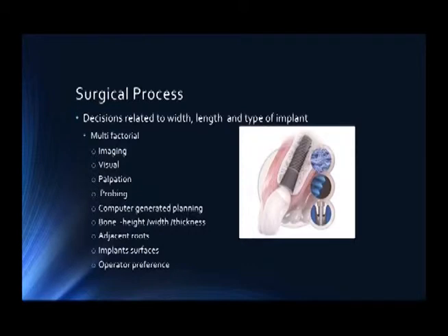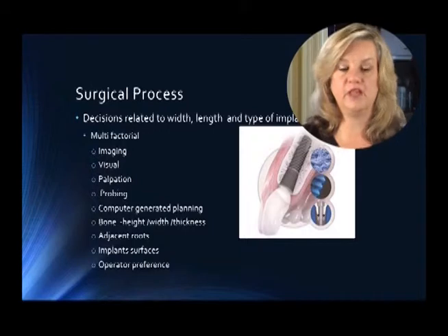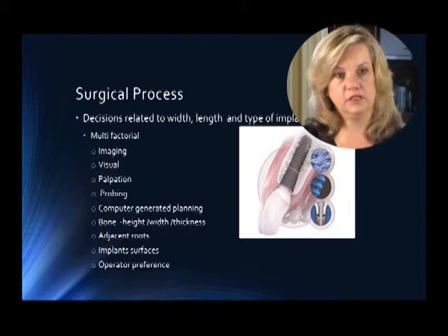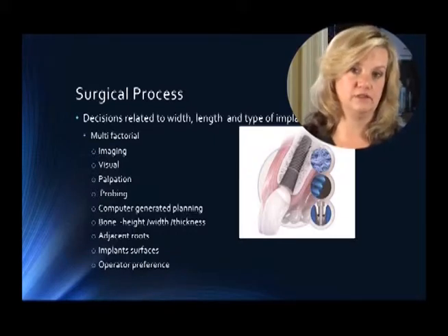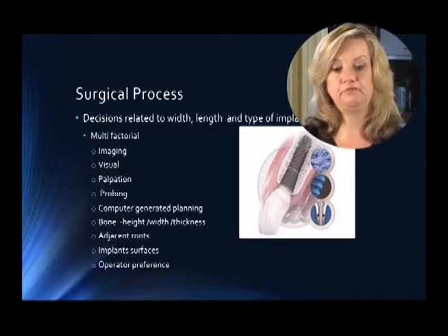Of course, I alluded to before, the computer-generated treatment planning that is available. There are lots of programs out there, and this is one of the areas that hygienists are now edging into, facilitating and working with some of these digital planning areas. Very interesting area of practice that might be of interest to you.